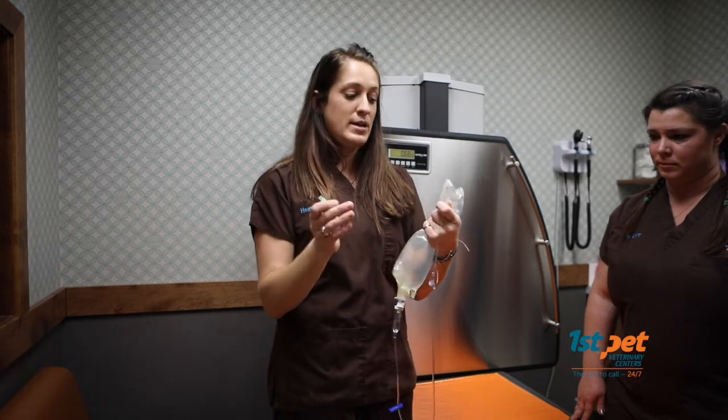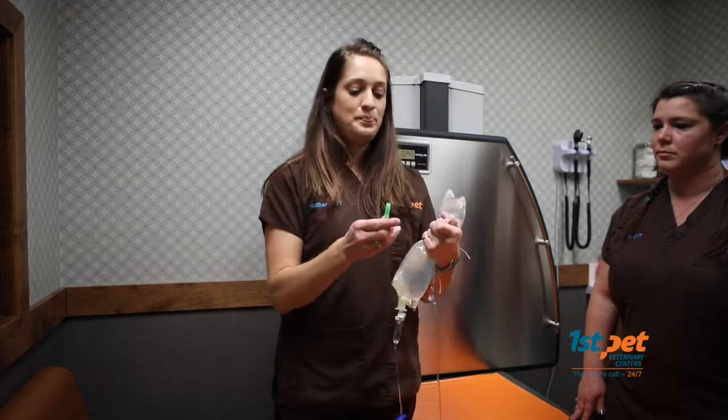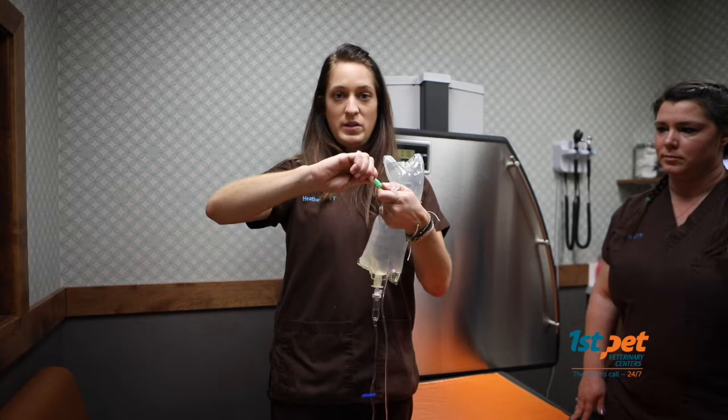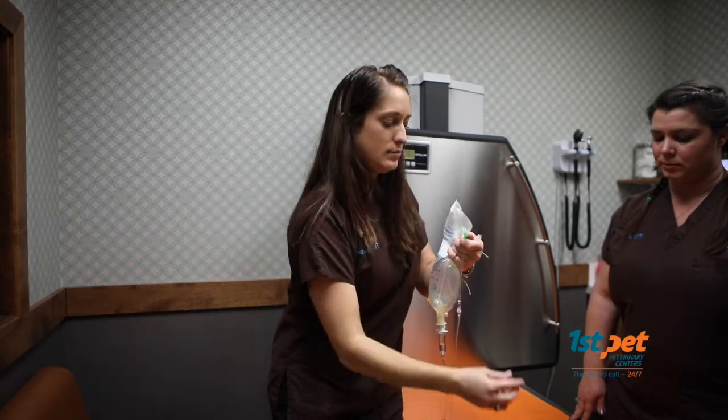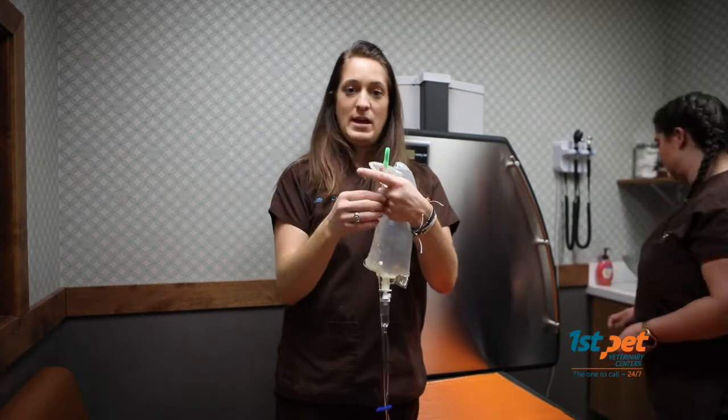To put a new needle on, it is still important that we don't touch this area, so we want to keep it as clean as possible. And then with your new needle, you're going to twist off the cap again until you hear the click. And again, you're going to put it right on your administration line.